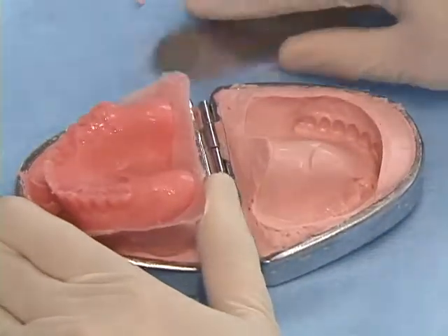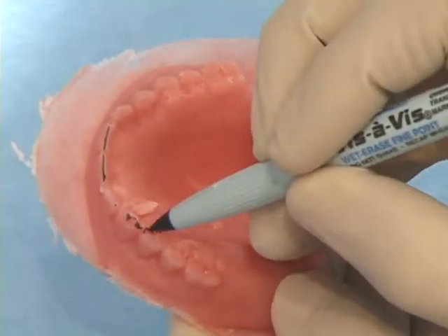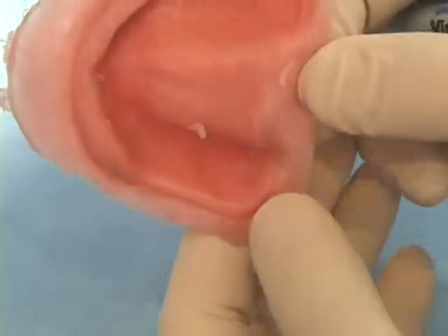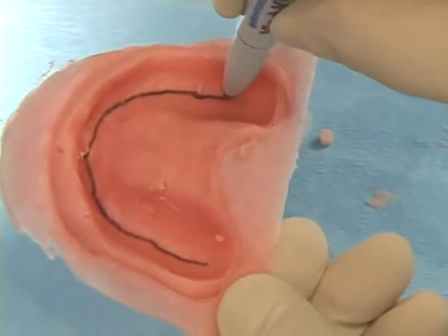When using an existing or duplicated prosthesis, draw a line on the occlusal aspect of the prosthesis, bisecting the incisal edges and central fossa, and another on the alveolar ridge side of the prosthesis, corresponding to its greatest concavity.